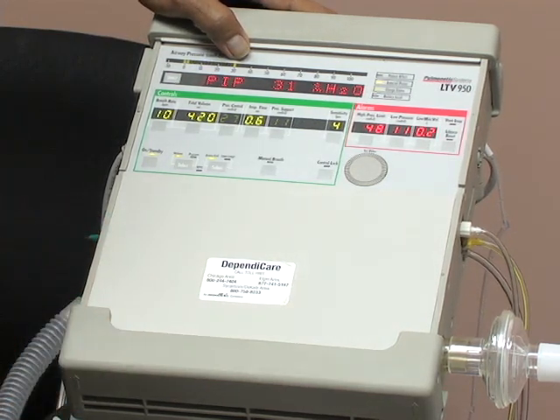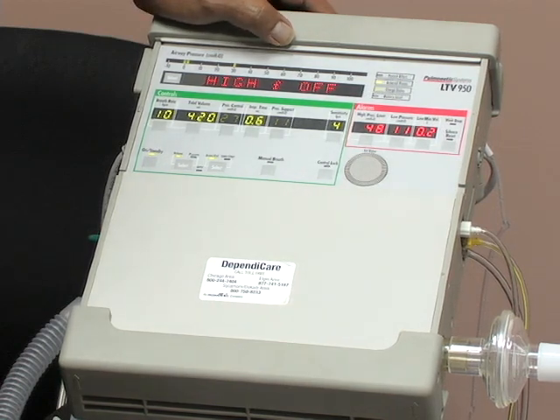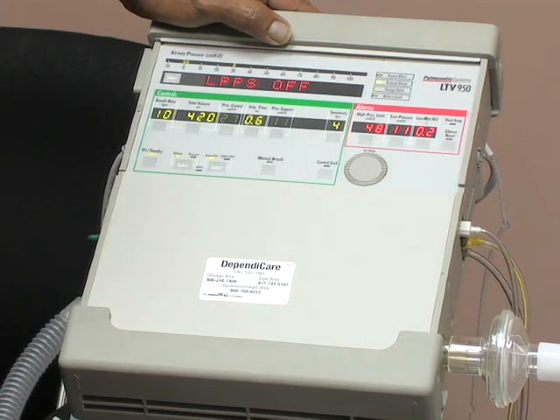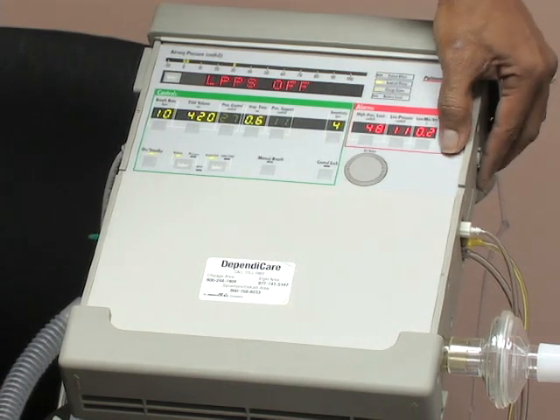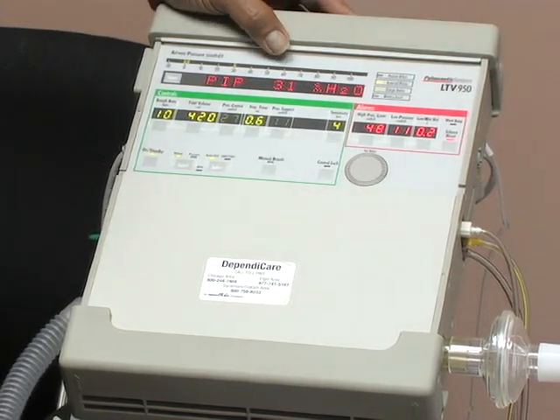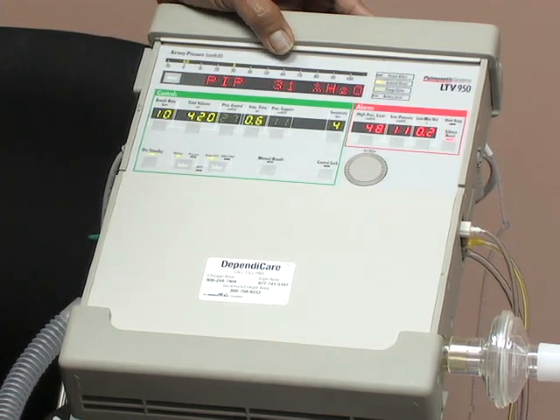So when pressure increases, there are certain things that can cause high pressure increases. That would be congestion, pulmonary plug. It could also be a crimping or obstruction in your lines. But when you see your PIP increasing, then you should be concerned to take a look and listen to your patient's lungs to see if there's any congestion that might be building up. It's a very useful indicator that you can look at any point in time that will clue you in to listen to your client's lungs and see why it might be rising.